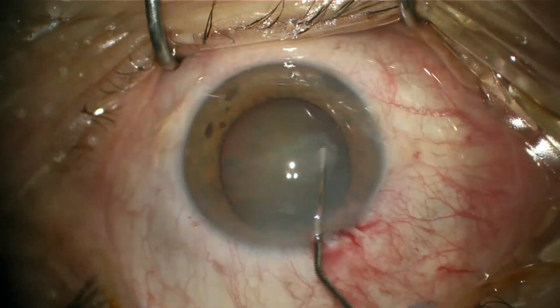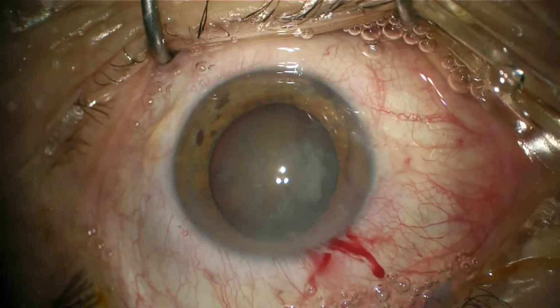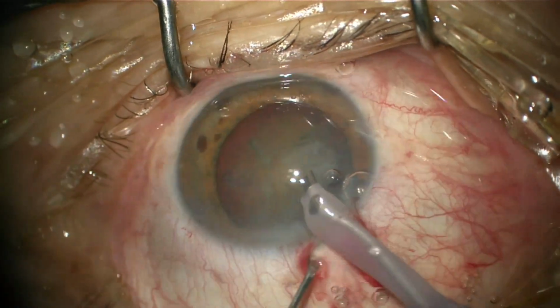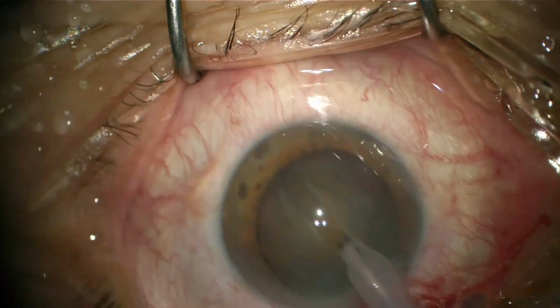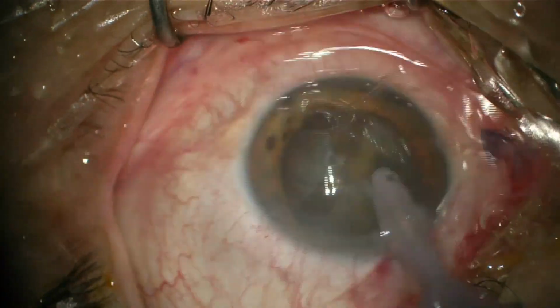Now the hydrodissection. And look how the pupil and the iris maintain good stability. There is no miosis or even prolapse of the iris. An IFIS case usually at this point will vomit the iris stroma through the main incision.